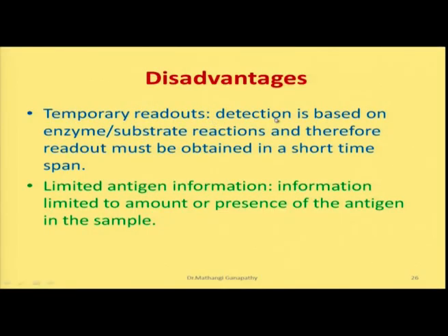Disadvantages: temporary readouts. Detection is based on an enzyme substrate reaction. Therefore, the readout must be obtained within a short time span, because the enzyme substrate reaction is time bound. Once it reaches the maximum level, then it will slowly go down, because either the substrate is completely used up or the enzyme becomes inactive, or both happen. So, it is a time bound experiment.